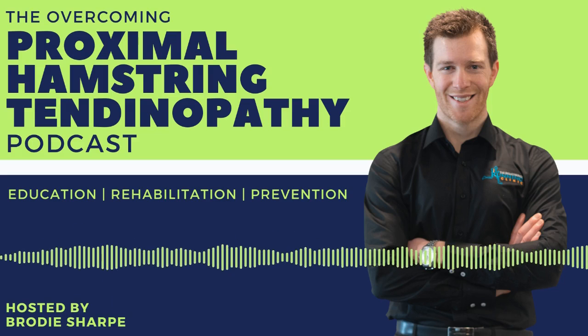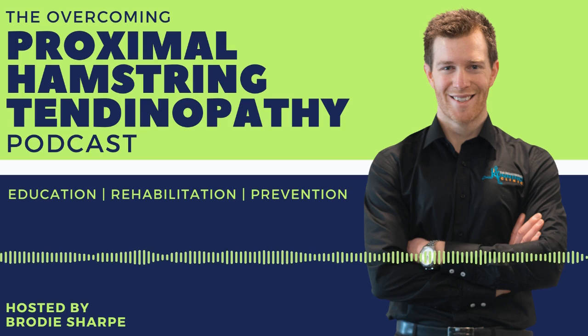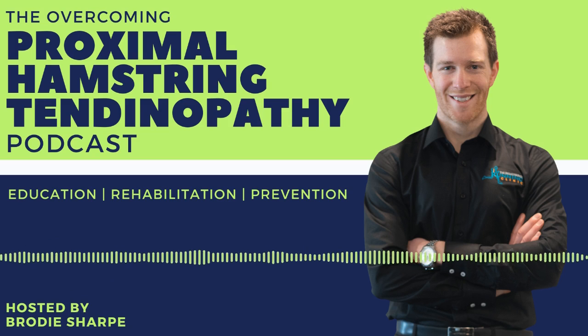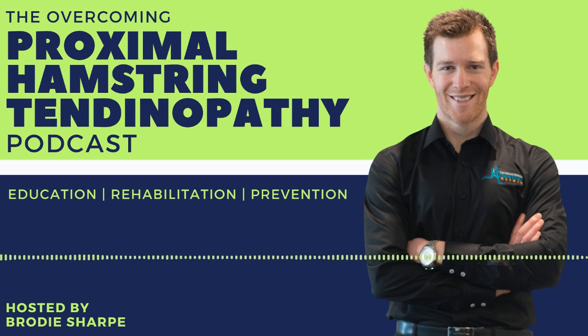One of the reasons you might have a bad reaction with Shockwave is that the symptoms should be stable. Many times I will decline Shockwave in my clinic because they come to me with very high levels of pain. They're coming in at 8 out of 10, limping, having night pain. That is a bad patient to give Shockwave, because it's a painful stimulus. You don't want to be giving Shockwave to someone who's already very sore and tender. Sometimes I might give a bit of prehab before Shockwave just to make their symptoms quiet. So for me, an ideal patient for Shockwave is somebody whose symptoms are stable, not more than 5 out of 10.